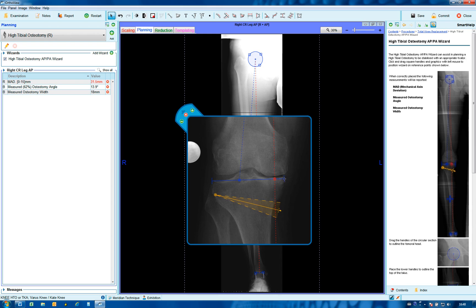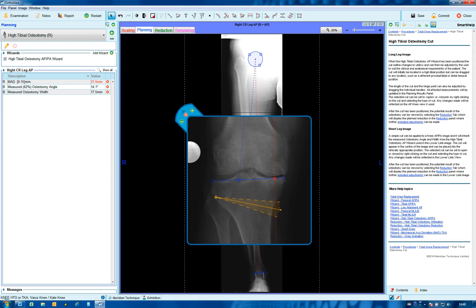As this is done, the necessary correction of the cut to bring the mechanical axis to 62% from medial to lateral — the Fujisawa point — is calculated. Then move the lateral hinge and medial cut point to the cortex.